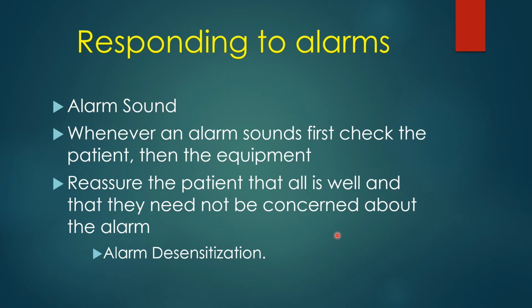And all these alarms are going off, but there's nothing really going wrong with the patient. And then in bed 6, a very critically ill patient who deteriorates really quickly comes disconnected from the ventilator, and the alarm starts going off, but nobody responds to it quickly because we've been desensitized to all these alarms going off all the time in the ICU.